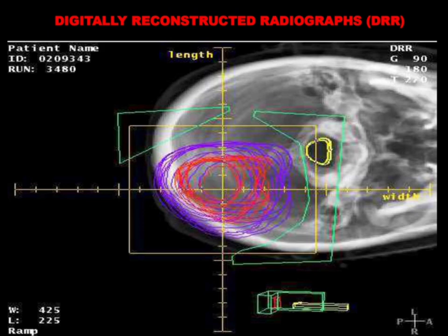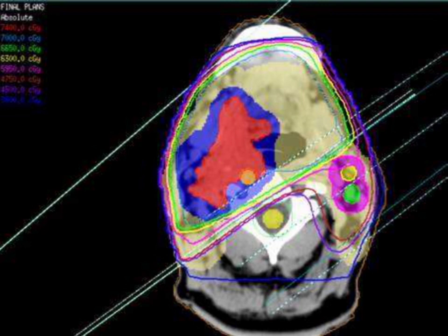What happens here is that we start contouring after the CT simulation, taking all the slices, first at the central section of the slice where the tumor is the most bulky, and from there to the upward slices that have a tumor, and the downward slices that have a tumor. So we contour all. After contouring, then we do a tumor plotting.